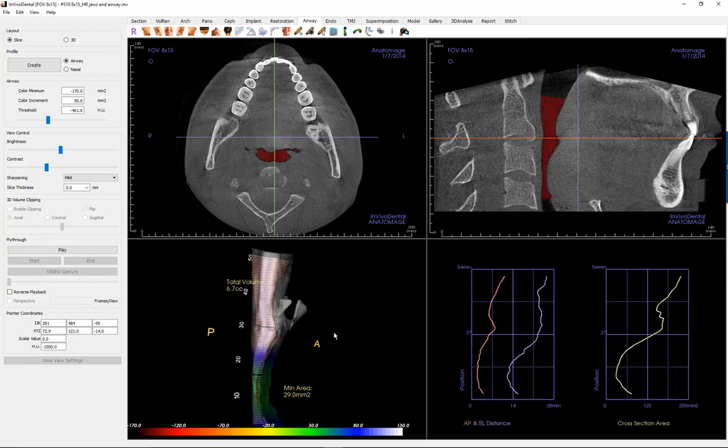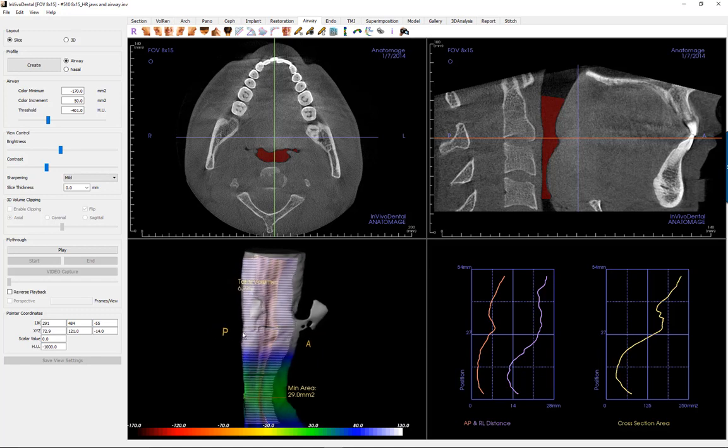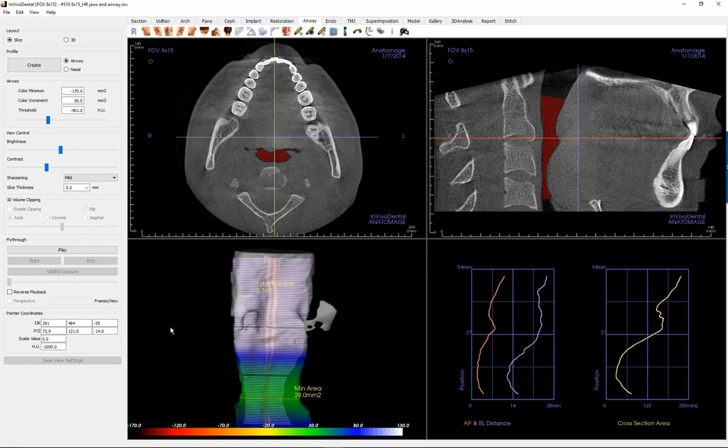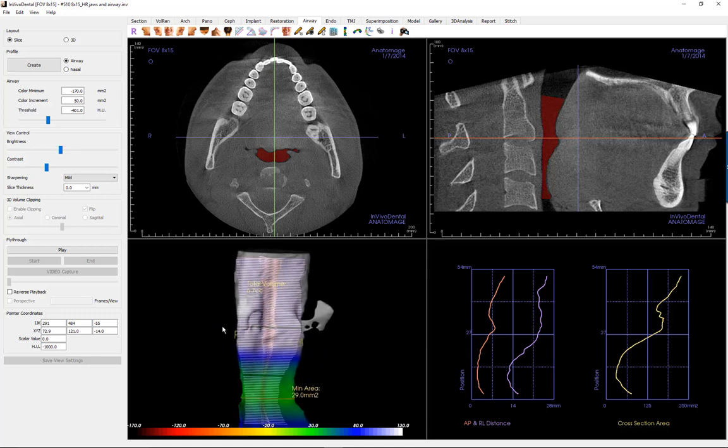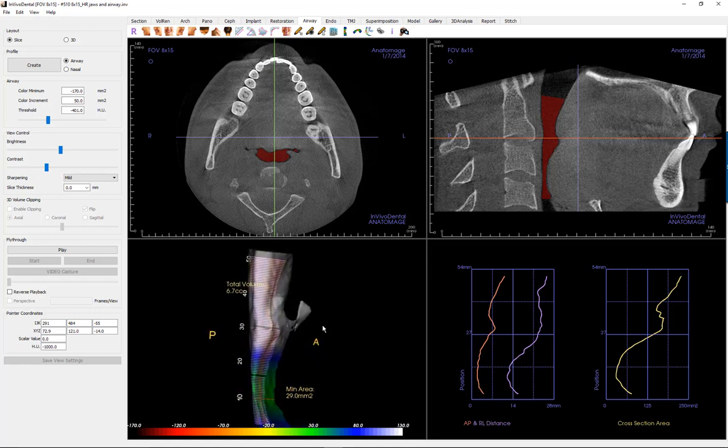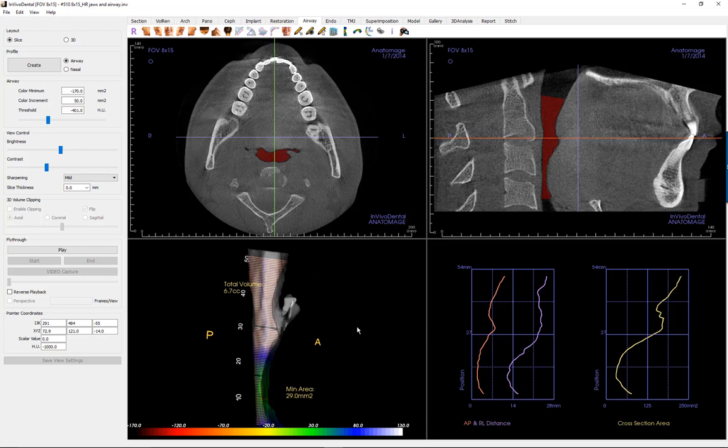The airway volume can be rotated to allow for a more detailed analysis and to aid in doctor-patient discussions. You may segment the airway by selecting the sculpting tool to remove any unwanted anatomy.